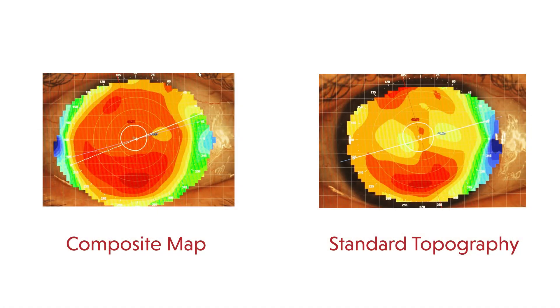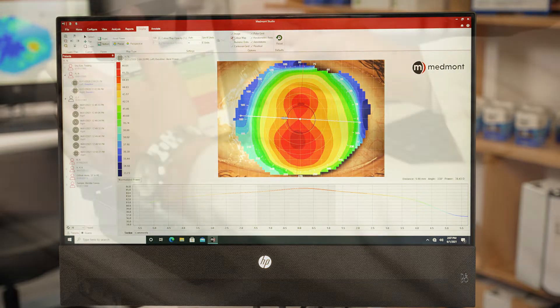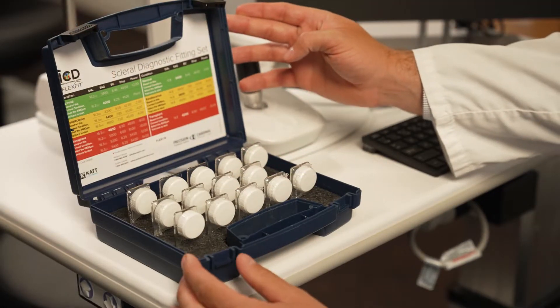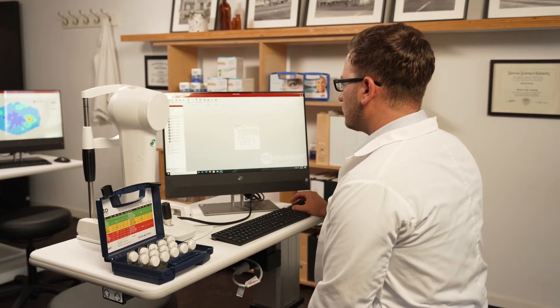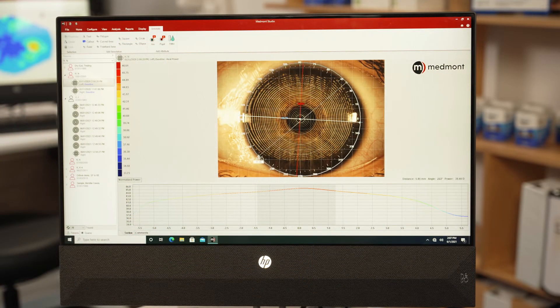The unique Medmont composite eye feature allows you to expand an already large surface area of capture to create a complete view of the corneal surface from limbus to limbus. This can be beneficial in the fitting of specialty contact lenses that may be as large as the corneal diameter or larger.